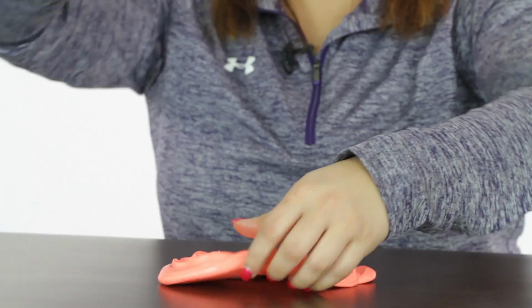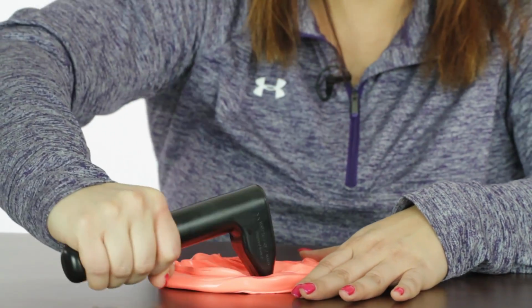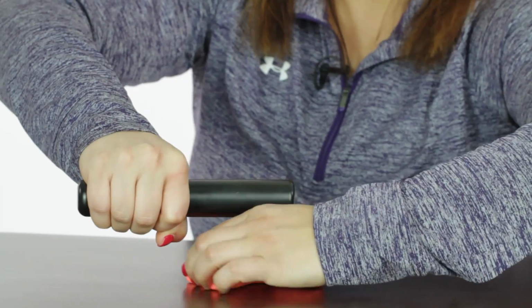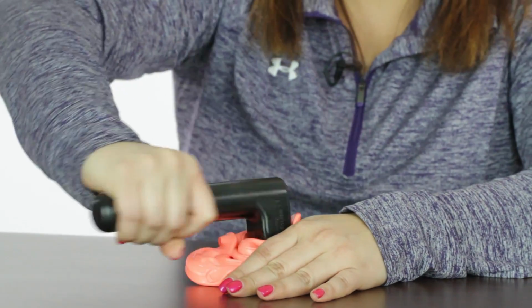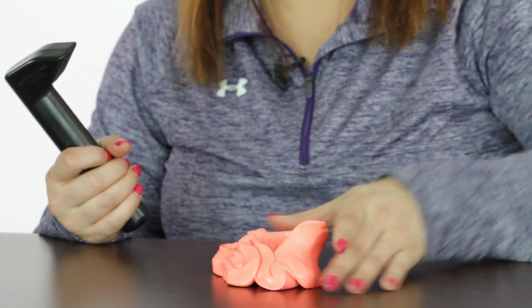We can also use this as more of a lever turn, so pushing down and going up and down with it. You can give it some more resistance by kind of building the putty up around it. So kind of using that lever turn to kind of dig a hole in the putty.